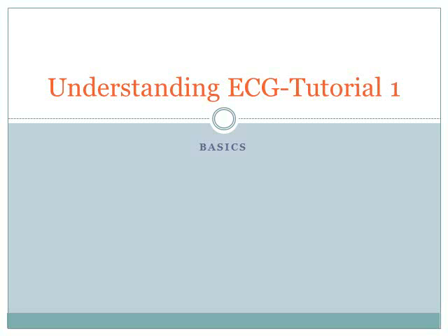Hi everyone, I'm gonna do a small tutorial about ECG. This is tutorial number 1 and I'm gonna just cover the basics that we need for the interpretations. So I'm a nursing student. When I was in the nursing school, ECG was one of the favorite subjects for me.